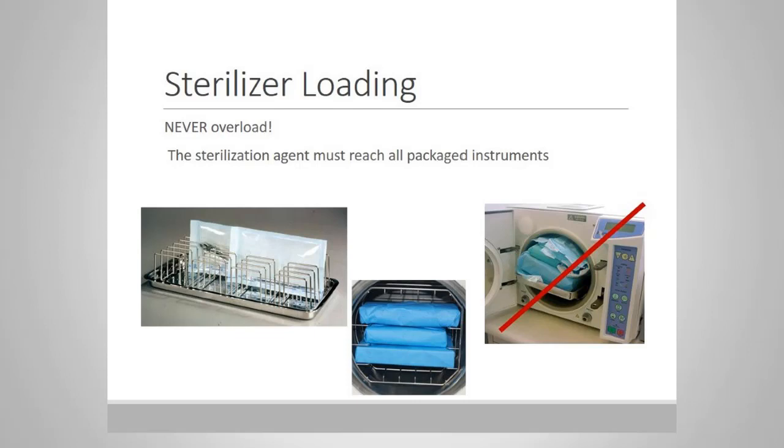If you don't have a rack such as this on the left-hand side, ideally paper side up, plastic side down, or plastic side up, paper side down. And if you are unsure of that, read your manufacturer's instructions to make sure that you are loading the sterilizer correctly.